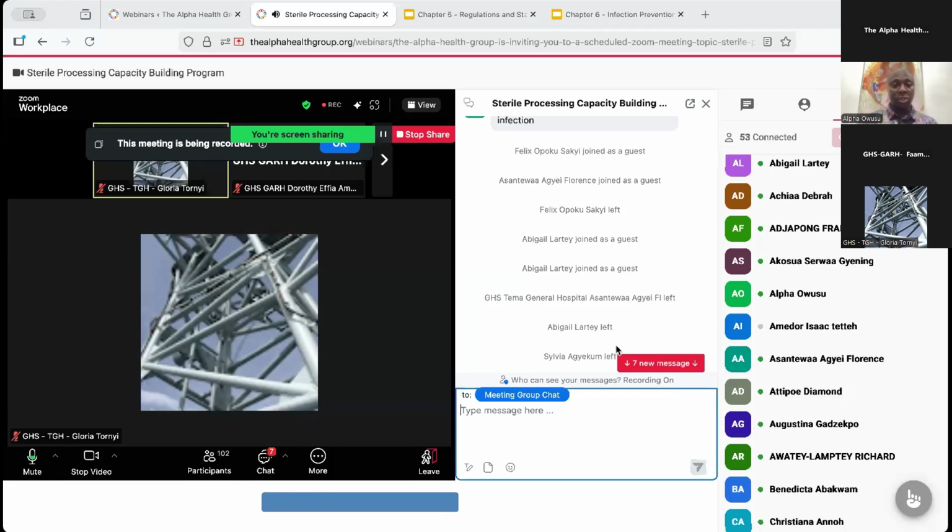You bring it to the decontamination area, where the decontamination area has a confined, monitored temperature and a negative air pressure, which does not let air go through the prep and pack area and the hallways, cross-contaminating other departments. You are preventing infection right here.